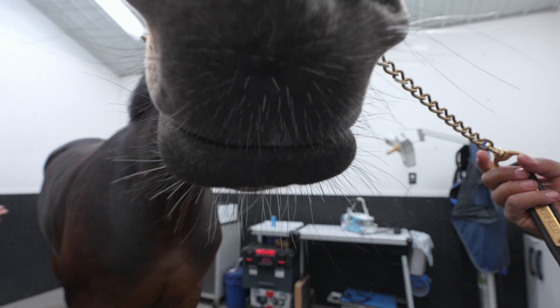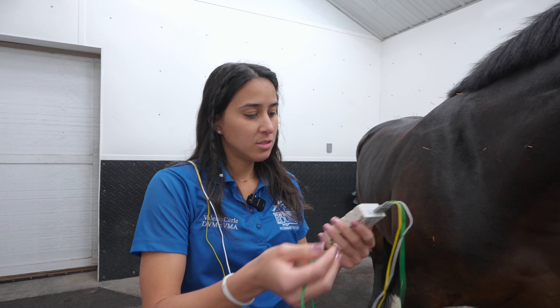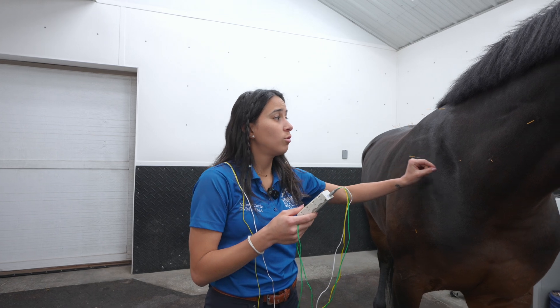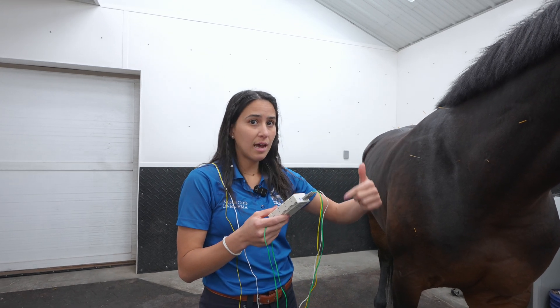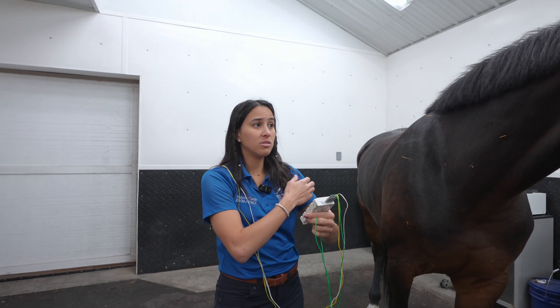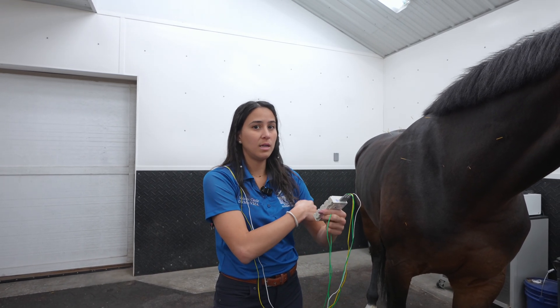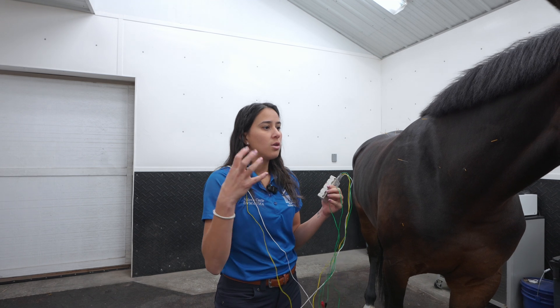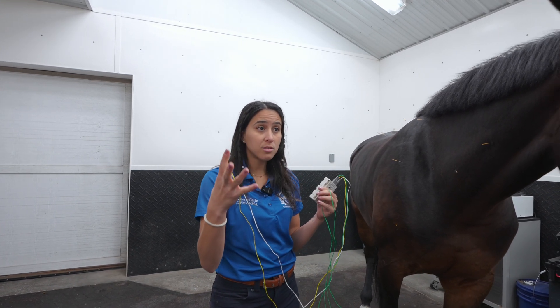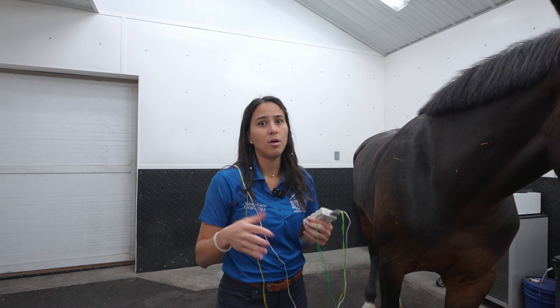Now we're going to start the electroacupuncture treatment. This little device has electricity that we will place on the needles, and it will go through the needle inside the body. It's going to be like a TENS unit, but instead of being on the skin, it's going through the skin through the needles. It will start helping those muscles contract and relax, contract and relax, until we get the desired amount of relaxation.